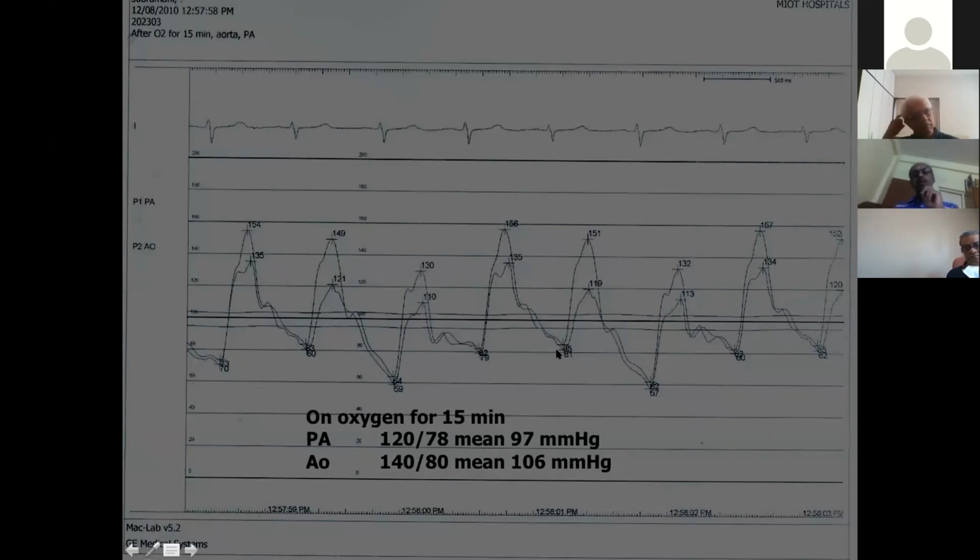I have many times stressed to my fellows, diastolic equalization is the rule in the large PDA. If you are having a PDA which is having a lower pulmonary artery pressure than the aorta, that PDA has got a mild restriction. There should be a diastolic equalization in a large PDA. Systolic can be higher. The reason why the systolic pressure is higher is what I already mentioned as the impulse gradient.